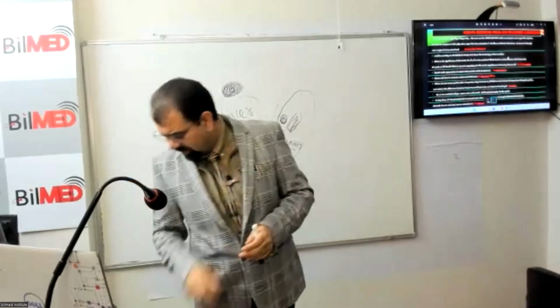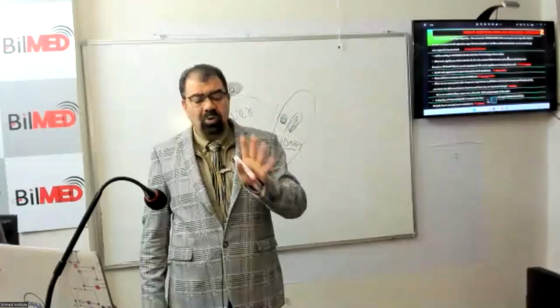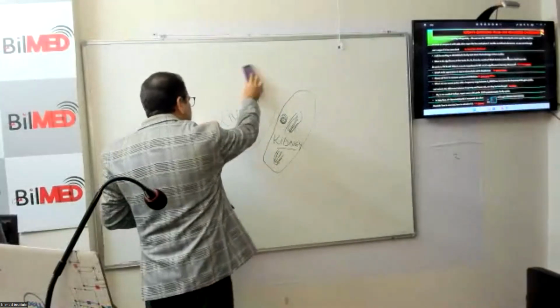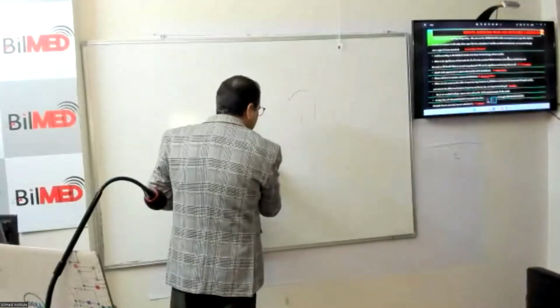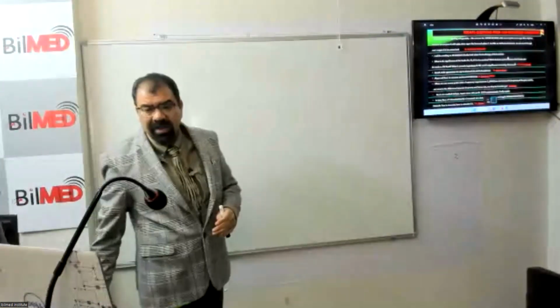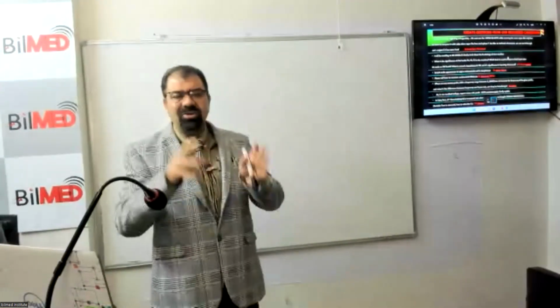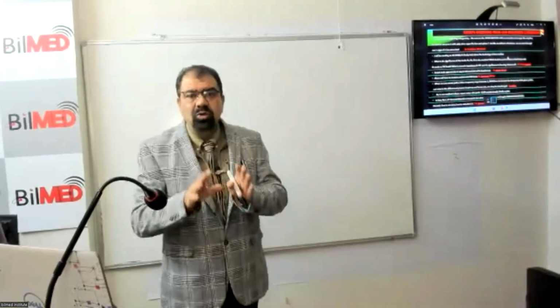But the basic important point is that you should know that you have to search for this knob, this knob, and that knob. You have to search for the frequency knob. There has to be a frequency knob. There has to be a knob for the dynamic range. There has to be a knob for the gain. There has to be a knob for TGC. Now, where it will be in a specific machine, that is humanly not possible.